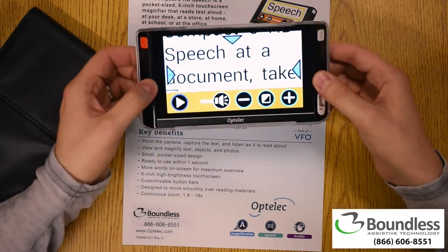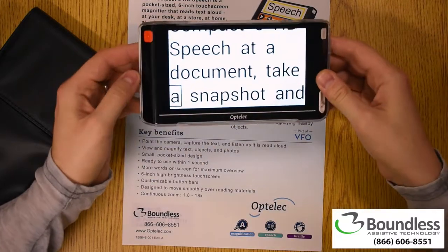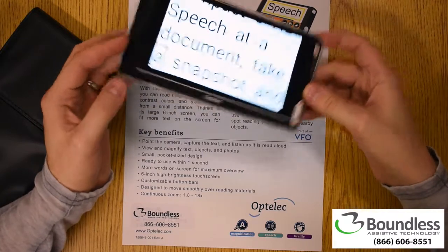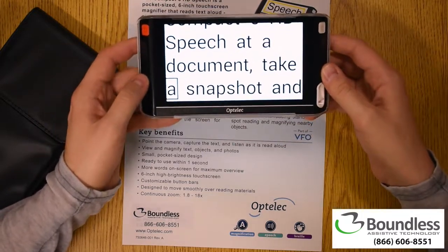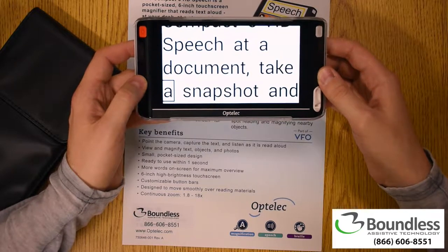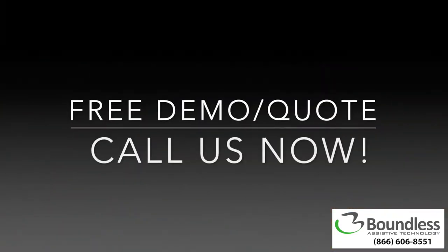This is really just a great way to have audio access on the go as well as magnification on the go. Definitely an exciting device. If you'd like to discuss it with us, please give us a call at 866-606-8551. Thanks so much.